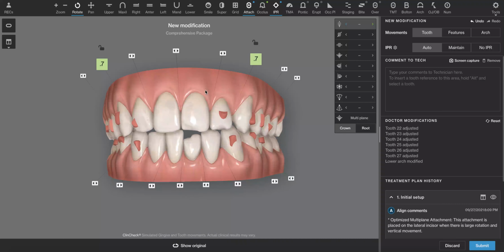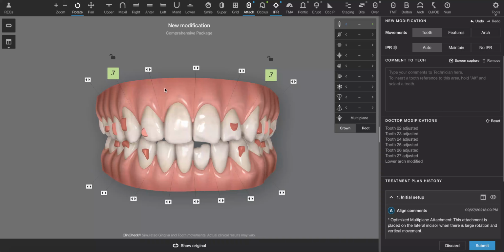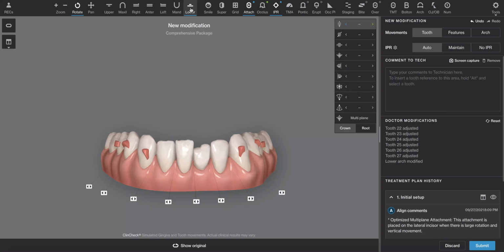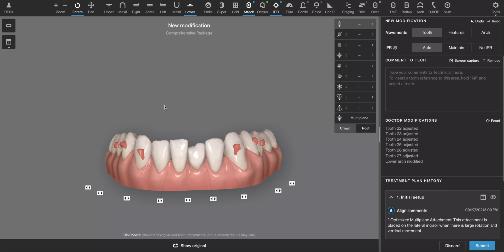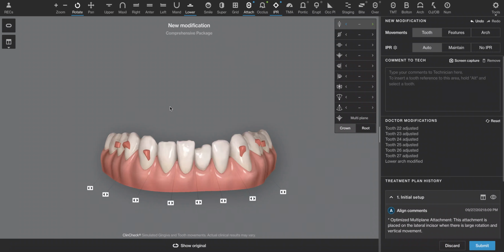I would tell the patient that we want to level his curve, maybe not use those words, but level his occlusal plane, and this is going to take more trays than it would if he went to another dentist and simply wanted to straighten his teeth. We are functional dentists, we're not aesthetic dentists. I always try to paint that picture to patients saying the aesthetics is in the eye of the beholder, meaning the patient. We will make things look as beautiful as they want, but at the end of the day, we want things to last for the patient. We want things to be functional. We want things to work better. That's the treatment goal here.